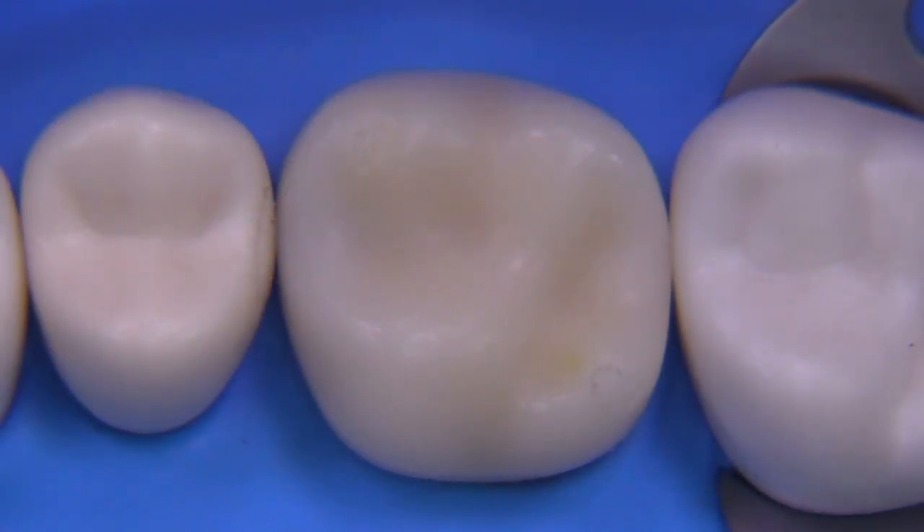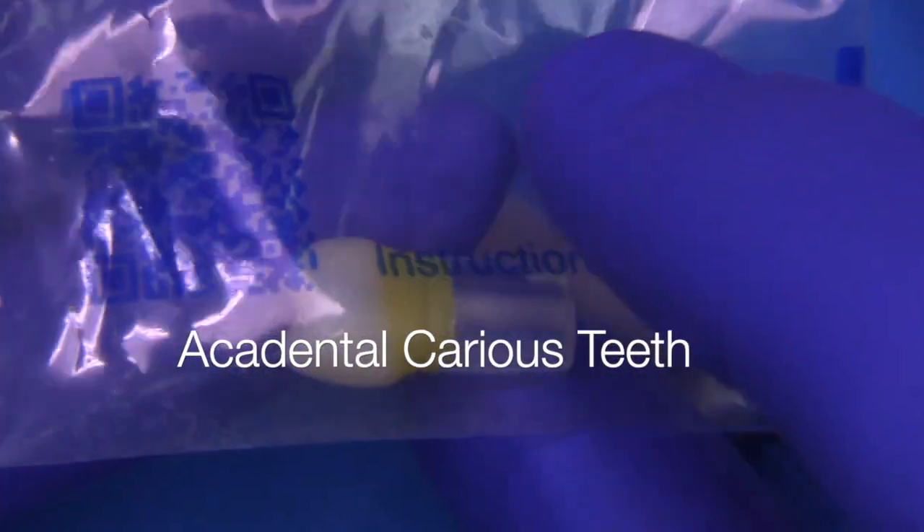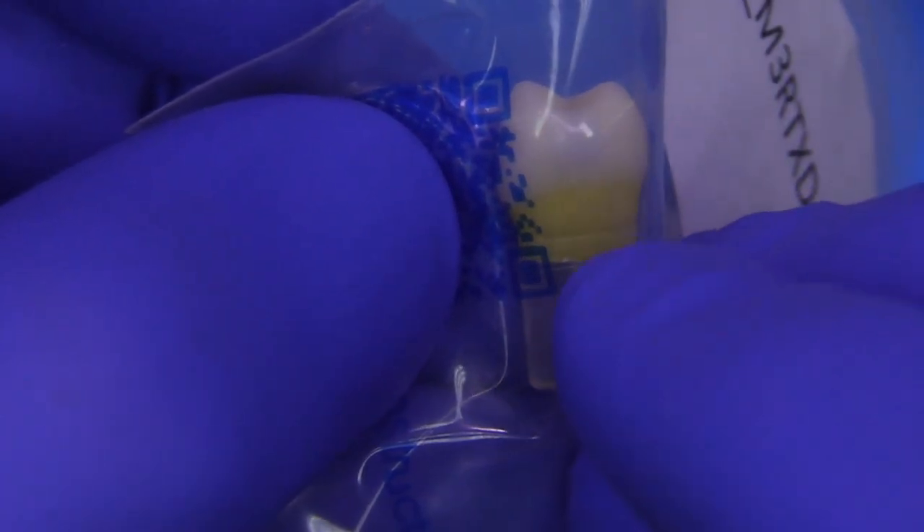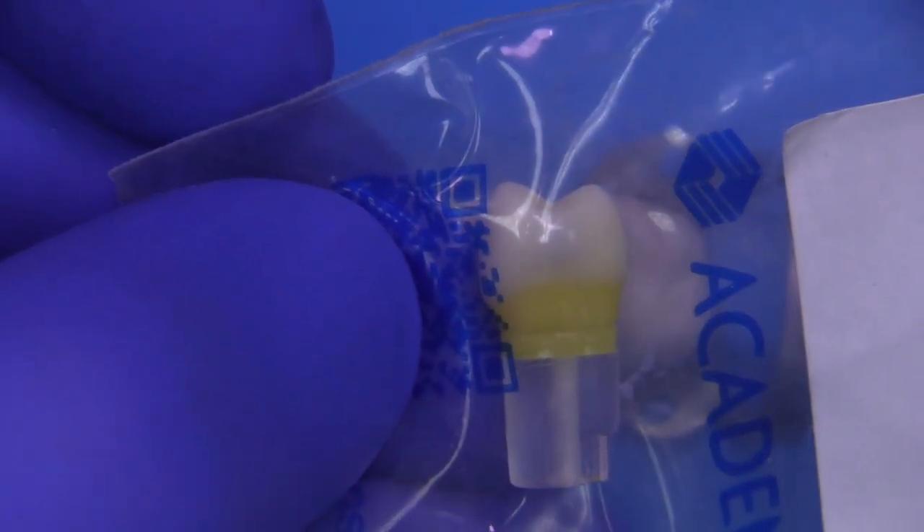This will be the first time I've actually worked on this tooth. You can see they come in different teeth and surfaces — I imagine they're probably going to try to include these in board exams in the future. You can see the caries on the proximal there.